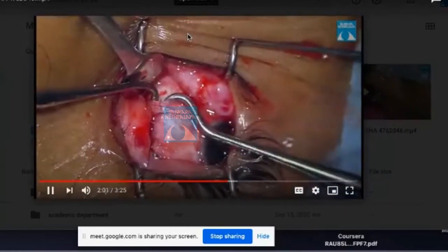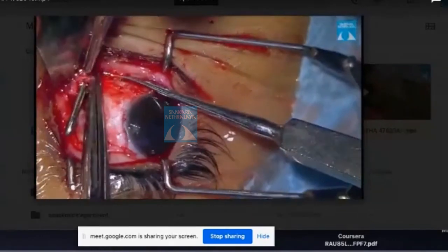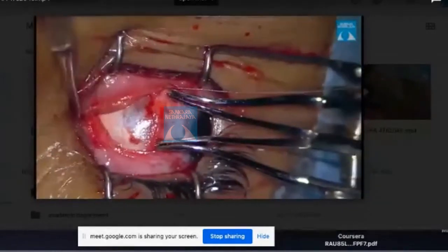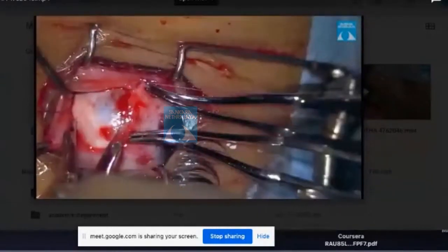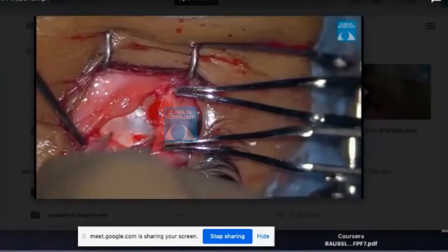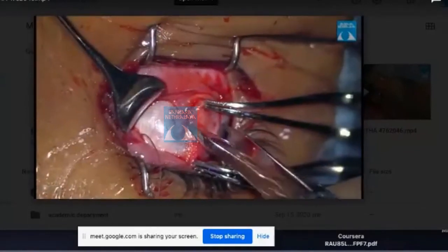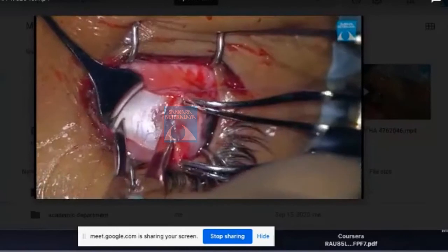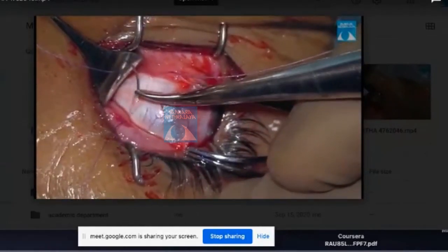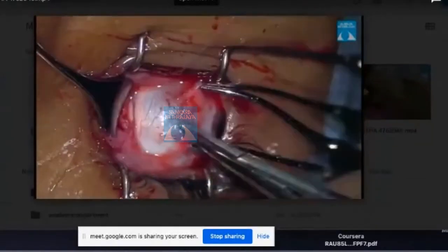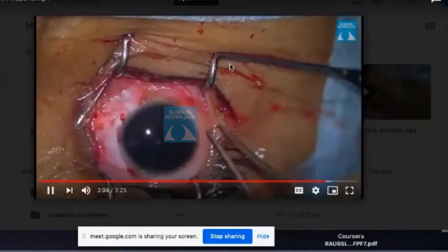Locking bites are placed at both poles of the muscle, then the muscle is disinserter. Measurements are made from the limbus — 11 mm in this case — marking the new insertion site. Partial thickness scleral bite, then a conventional recession with scleral bites is performed. The wound is closed with sutures at all corners and the conjunctiva is teased and closed.